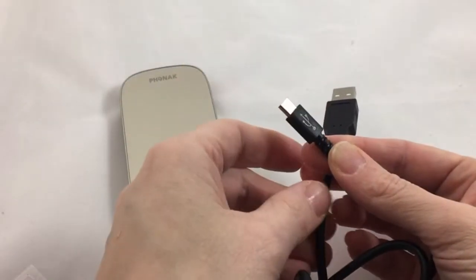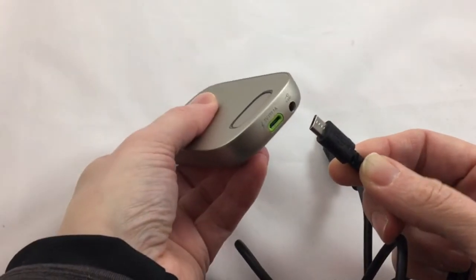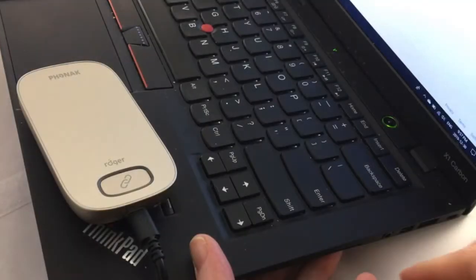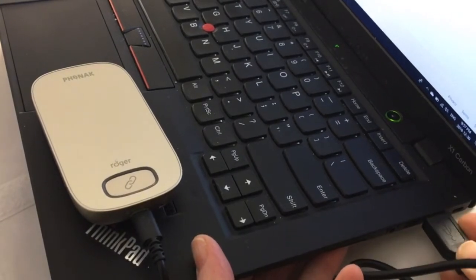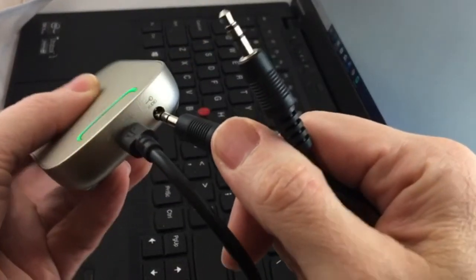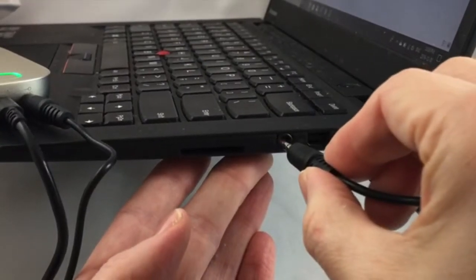Next, plug the Micro USB into the Multimedia Hub. The USB, on the other end, then connects to your audio source. Here you can see it being attached to a computer laptop. Next, plug the Multimedia Hub into the Audio Out Jack of the tablet or other audio source. Here it's being done on a laptop.